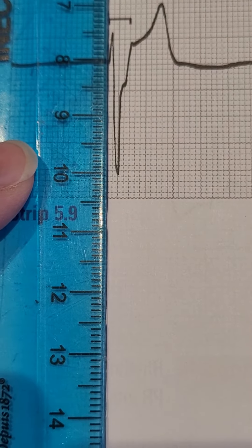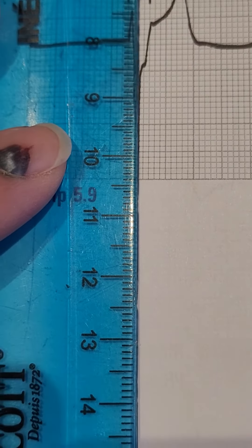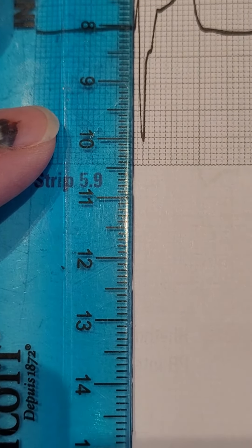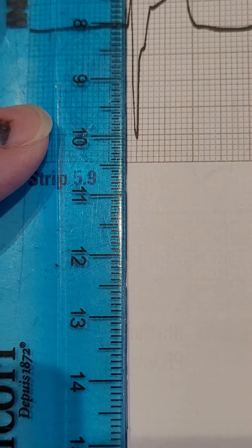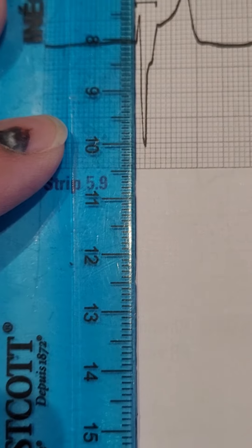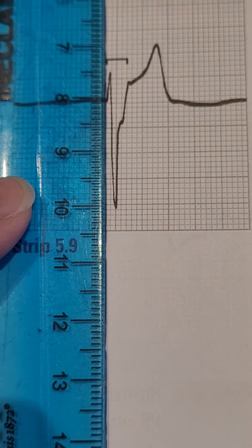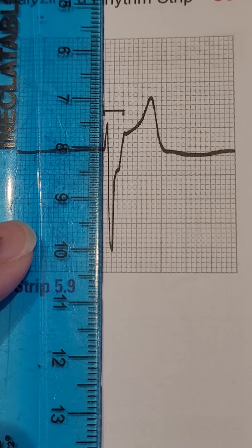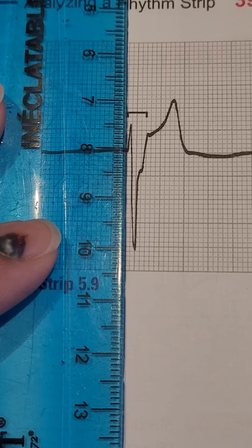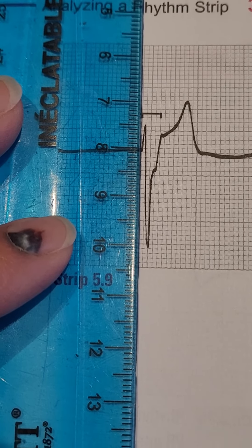Let me see if I can do this. Line up almost at the beginning of that box — one, two, three — and almost here. Maybe three and a half to four small squares is the duration of this QRS complex. So you and I can be off by one small square on a test and you'll still get it right. But you are on the right track and looking at the correct things if you and I are having the same counting dilemma of small squares on this particular image.